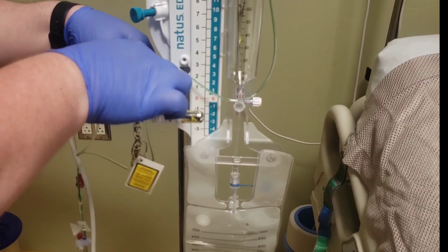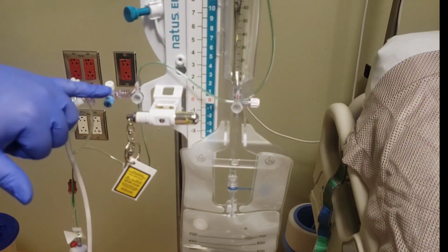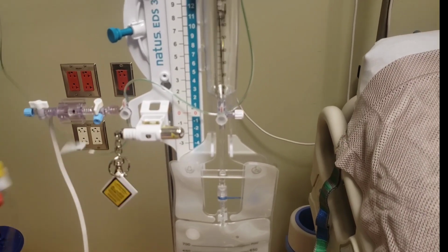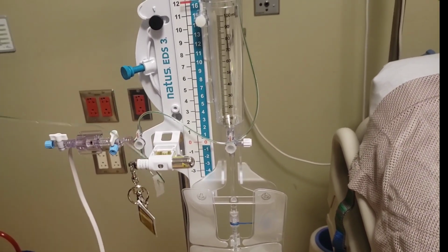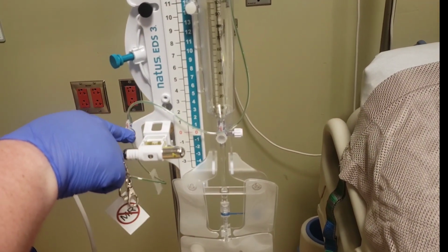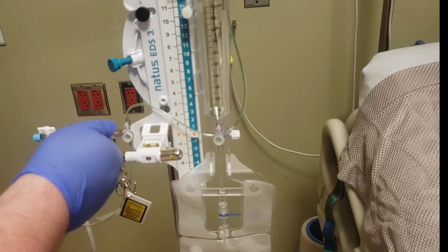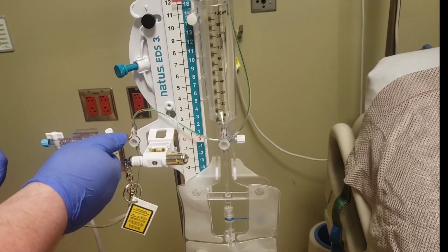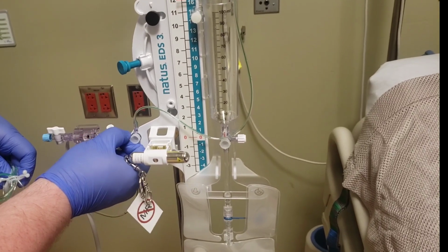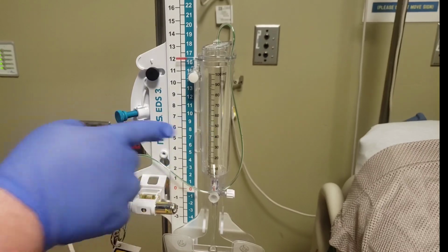The drain is in my patient's head, I'm following my drain, and I see my lever is off to the drain, onto the transducer. So I need to open the drain. What I'm going to do is flip my stopcock this way to drain into my burette.